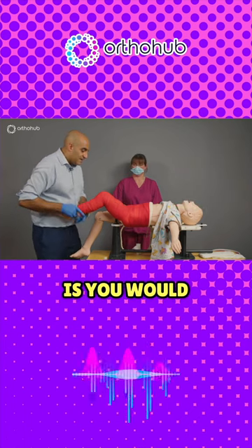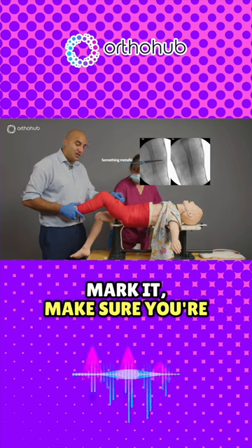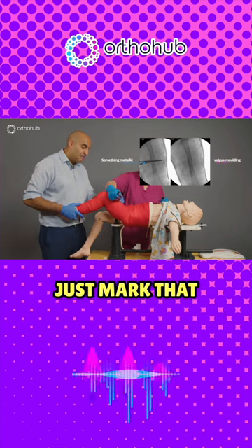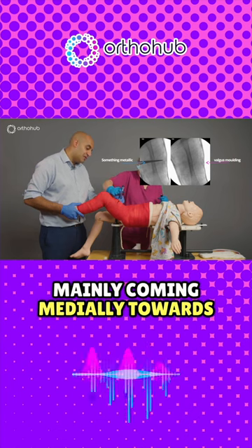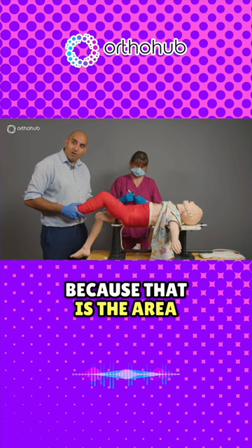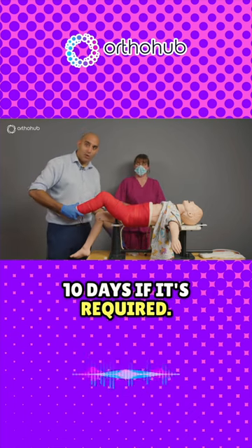The final step now is you would get your x-ray machine in, use something metallic to mark it — make sure you're at the level of the fracture. Just mark that level of the fracture all the way across, mainly coming medially towards the groin as well, because that is the area where you're going to have to wedge the plaster at seven to ten days if it's required.